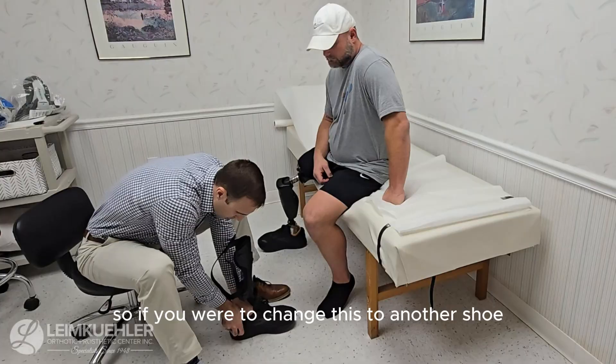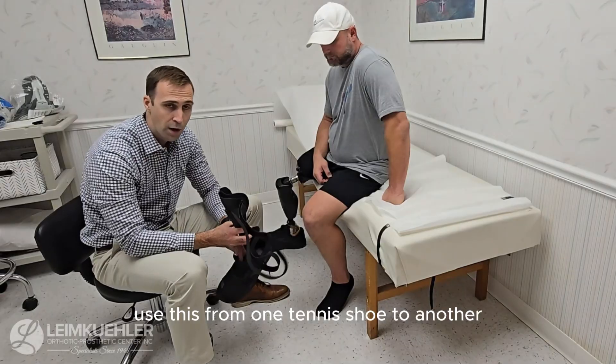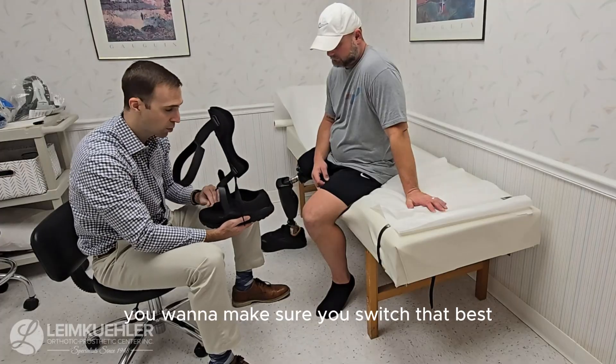So if you were to change this to another shoe, you want to make sure you're doing this process. You use this from one tennis shoe to another, or maybe you have dress shoes — like when you're using this for work or for the gym — you want to make sure you switch that.